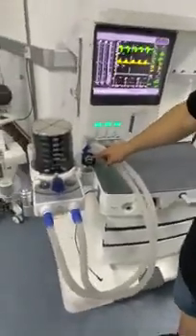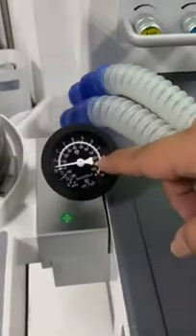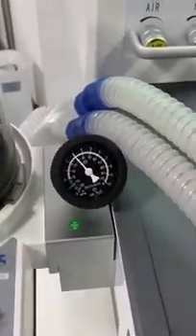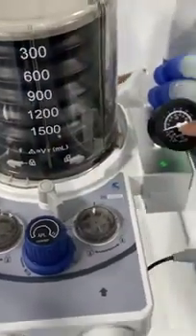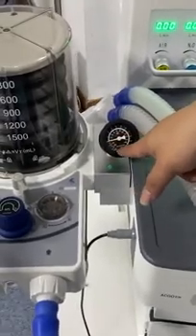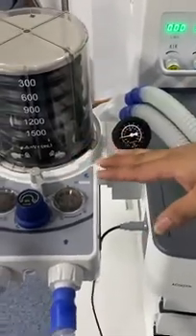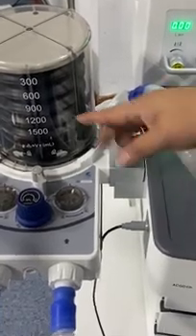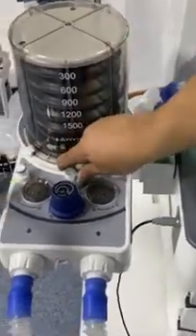This is the total pressure gauge. This gauge is also very important. For example, sometimes if we think the machine has any leakage inside, then we can move it to manual ventilation, and then we will check this gauge. If this line never gets to zero, then it means there is no leakage. If the line is getting to zero slowly and slowly, it means the leakage is inside.